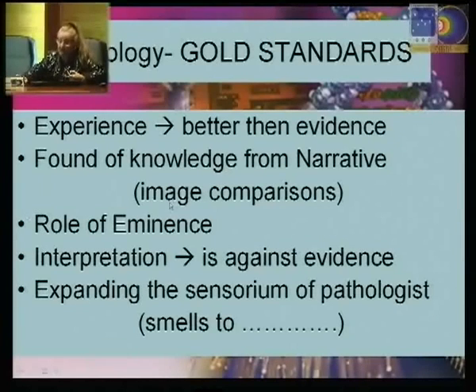And this is the reason why we are pushing so much the project of training pathologists quickly with image comparison, in order to have as many pathologists as possible trained on a new tool such as this one. Obviously, there is an eminence role. In pathology, everyone knows that they say this is this because I say that this is this. That's all. Full stop. No question about it. And this is this because I'm an eminence in the area of the pathology we are talking about.